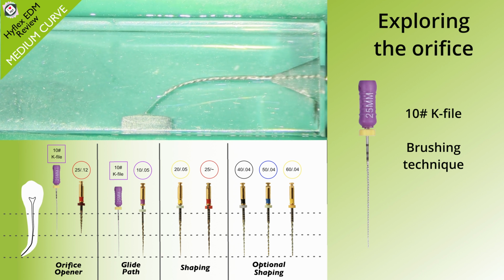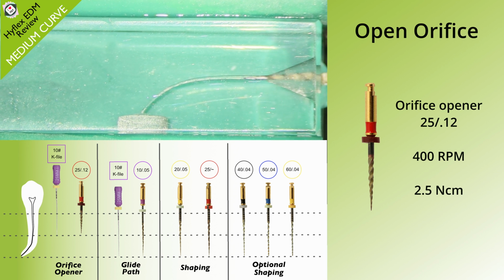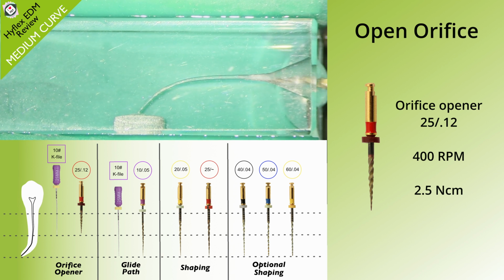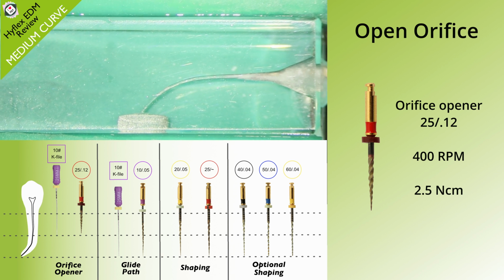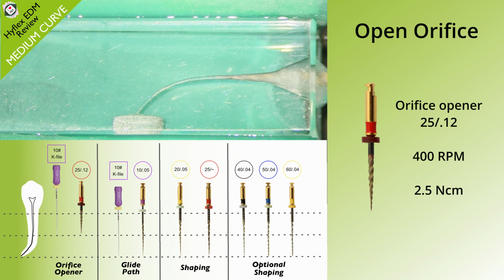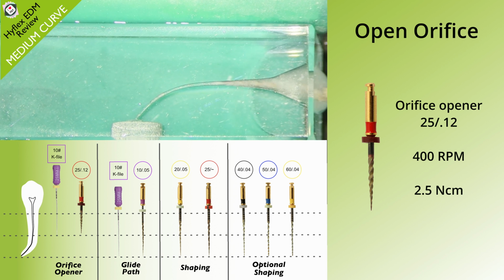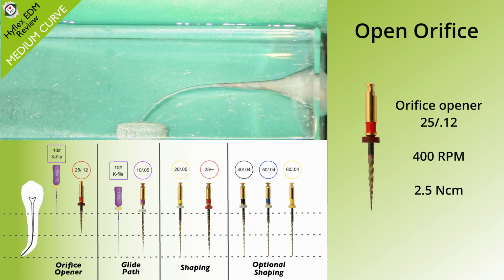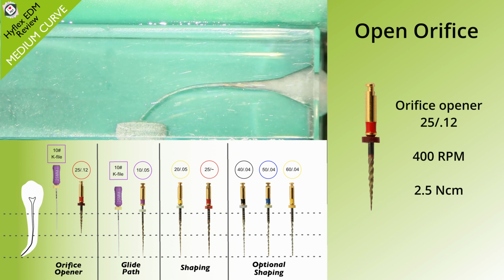So the second protocol is a medium curve, and here again we're demonstrating a plastic block and we're exploring the orifice with the size 10K file. We are then again going to use the dedicated orifice opener, and as mentioned before, this opens up the orifice. It centres the orifice within the pulp chamber and also creates a nice path for your files to locate into and helps with irrigation.